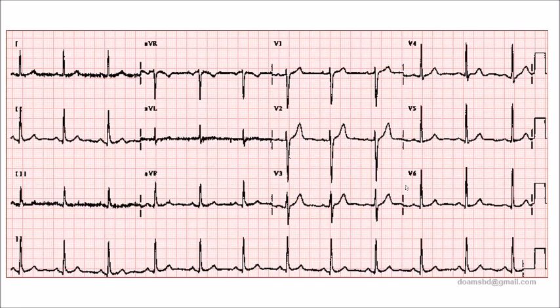No one responding. Interesting. You look at the waves, and the leads, already 12 leads in different positions, segments, intervals. If there are any major gross findings, I think it will become very serious. Otherwise, this is the normal ECG: rate, rhythm. And the rate, rhythm lead will be told as the rhythm strip.